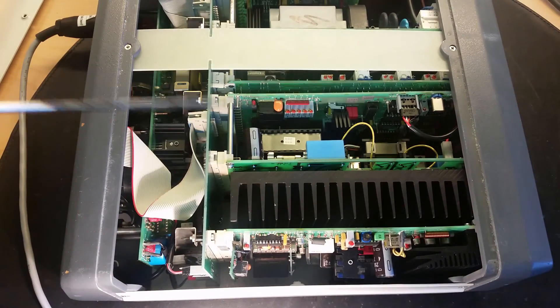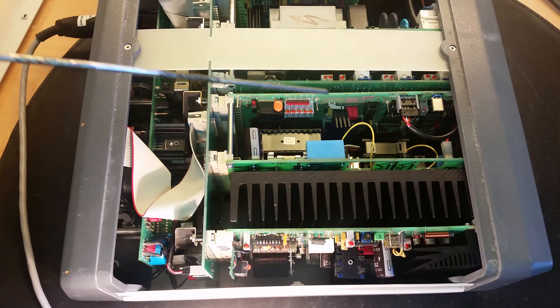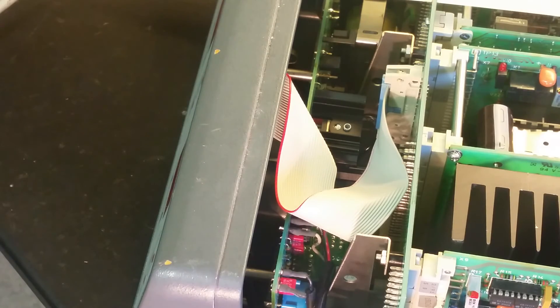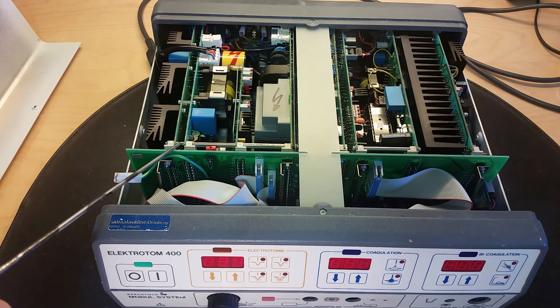Over here you can see three potentiometers - that one, that one, and that one - and they are motor driven. There were no IC potentiometers at that time. There's a switch mode power supply for the logic, and there's another transformer-looking thing - that's the choke for the output - some transistors and small components all around. There are 12 different circuit boards in this thing, not even counting the display circuit boards on the back - just the main boards, this big motherboard, and the little output board. There are a lot of circuit boards in this little unit.